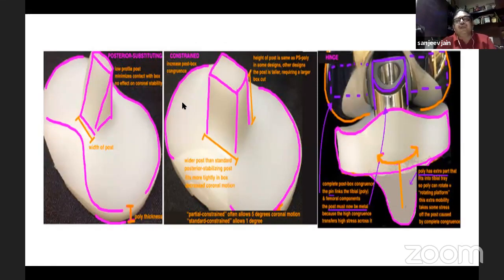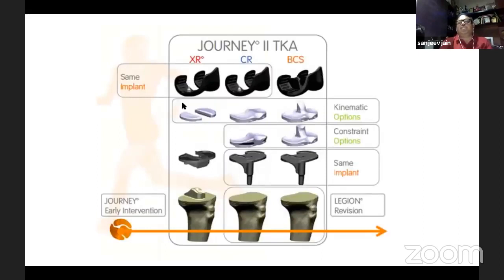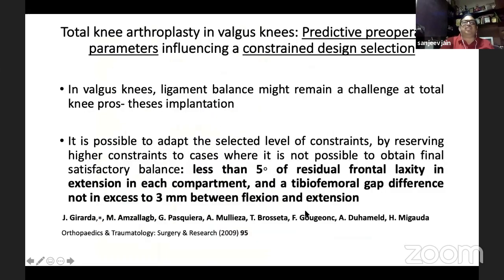So this is how these constrained inserts look like. Please remember there are varieties of implants available in the industry, and there are some implants where you can use only the primary PS joint without needing an extra bone cut. There are some implants, like TC3, where you'll have to make a little more bone cut and use a little wider one. But some companies use something called a PS plus. The femoral component remains the same, and only the constraint can be accommodated in the same femoral component, which is wise to use in this kind of situation.